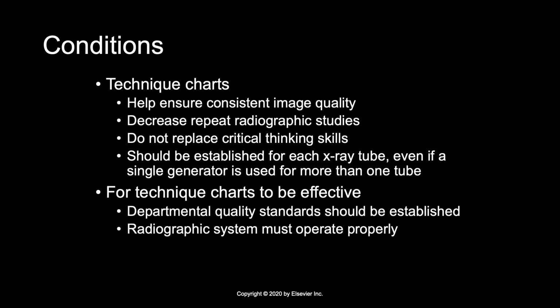For technique charts to be effective, the radiographic system must operate properly. A good quality control program for all the radiographic equipment ensures monitoring of any variability in the equipment's performance. We need to make sure that we've got some QA going on there for all of the different equipment.